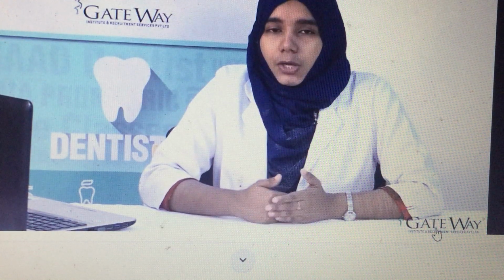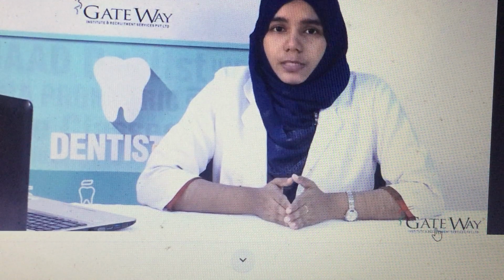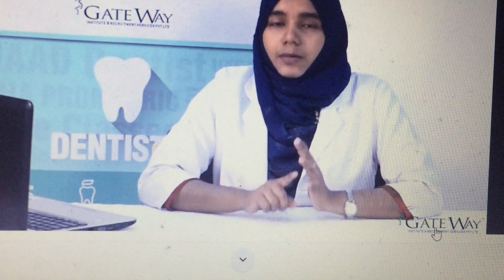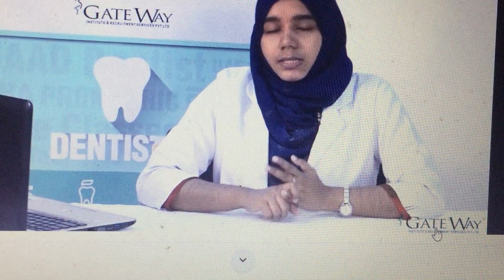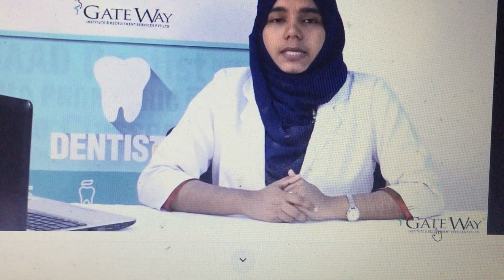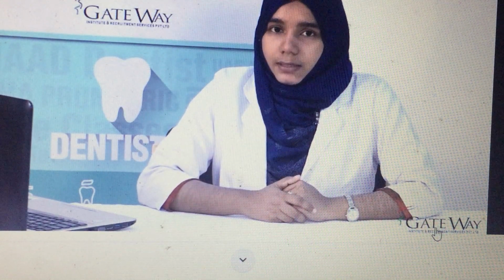These are the main points included under instrument stabilization. First point is about grasp. Here modified pen grasp is preferred. Second, about rest. Rest can be intraoral and extraoral rest. After this, sixth principle, that is instrument activation. Under instrument activation, many points are there.